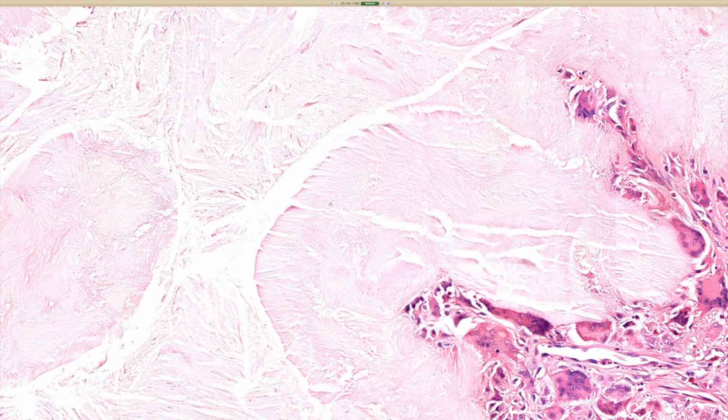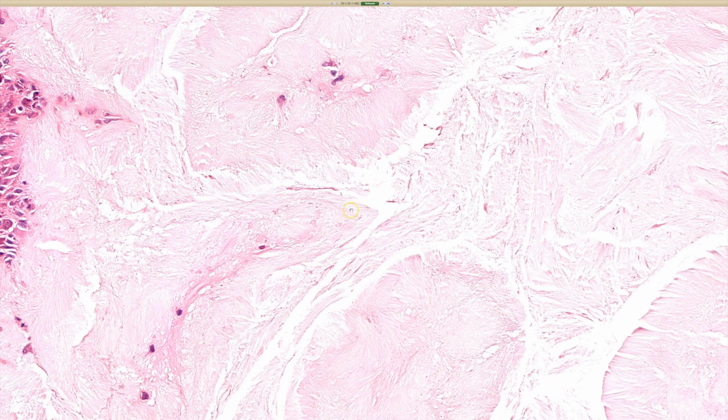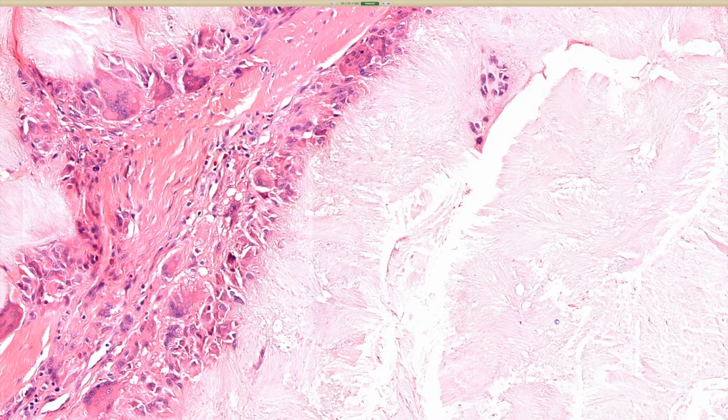Sometimes if you cut an unstained slide and melt the paraffin wax off of it and don't do anything to it, don't stain it or coverslip it, you can see residual crystals. Sometimes little chunks of crystals will get left behind and not dissolve. Usually they'll look like a brownish area on the slide instead of this pink stuff. Somebody asked me once, what is the pink stuff that's here? It's not crystals. Is it collagen? Is it fibrin? I don't actually know. I suspect maybe it's fibrin, but I've never tried a trichrome or anything here to figure it out.